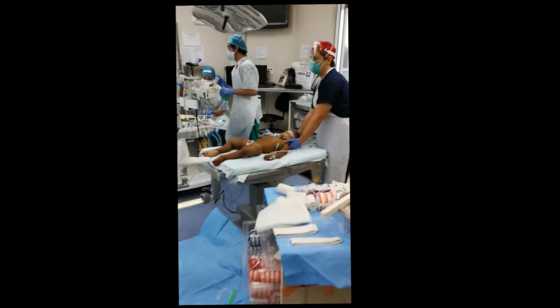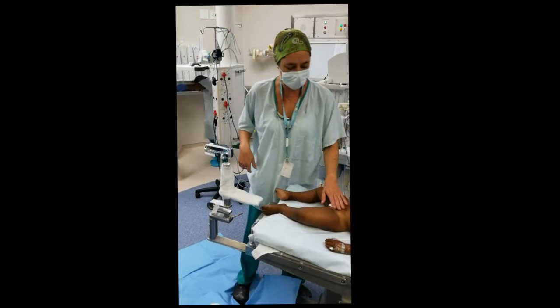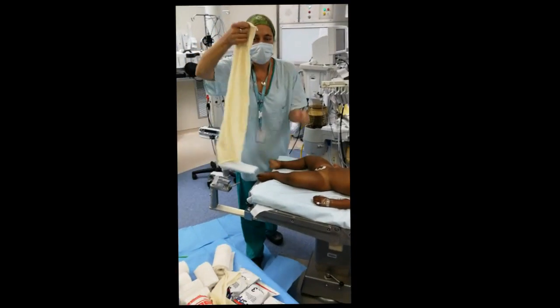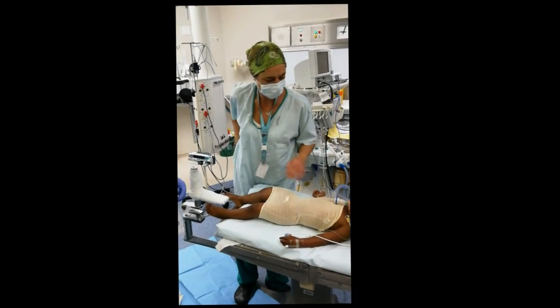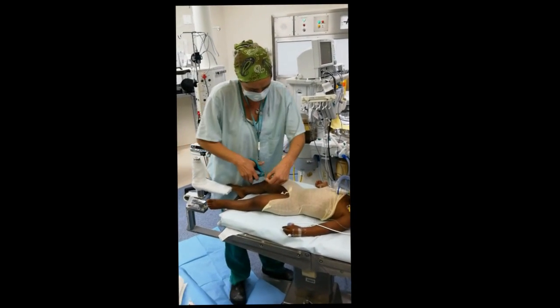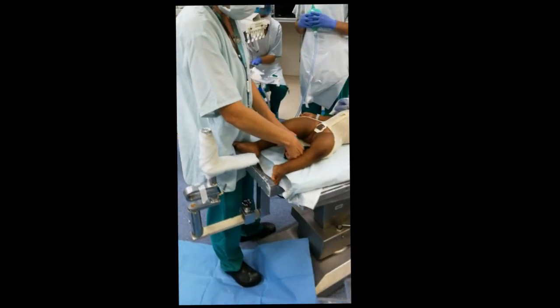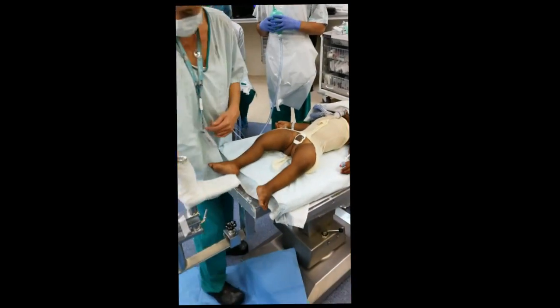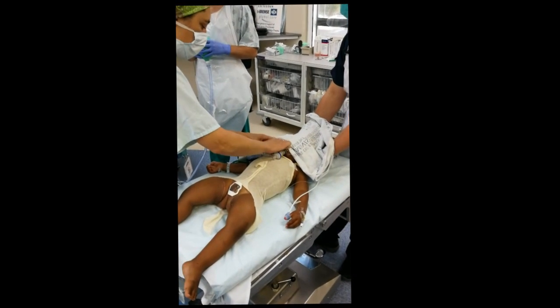Once the patient is seated, you wrap — make sure it doesn't cause pressure on the patient's body. Place a little padding over the genitalia. Before you move the patient down, start by applying the stockinette. The stockinette for the spica should reach the level of the patient's nipples, so make sure you release it. Then just cut the stockinette at the front and also at the back like this. If you have tape ready, use it to secure the stockinette to the chest so that it doesn't move down during the application process.